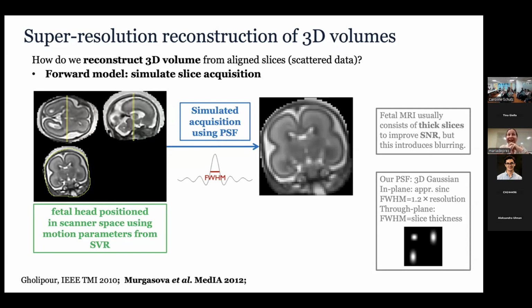I haven't tried it, but at DHCP, Joe really wanted to push resolution, but they did 1.1 in plane and 2.2 through plane, and it was at the very limit. If you review the data, you will see some subjects where the cortex is buried in noise. So you really cannot go higher. He really wanted to go higher, but it's buried in noise. I think people have been doing it long enough to know what they should do. They tried. So I think we are with this.